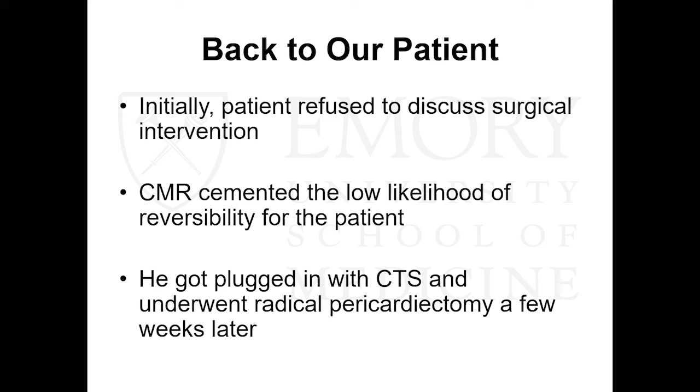So we continued some IV diuresis while he was in the hospital, and we were able to look into the CMR. At the time I didn't really understand how CMR would help us understand the reversibility of this. But looking at some of the data that I just presented, we were able to get really concrete data for him and show him that he probably wasn't going to have a reversible outcome. Some of our patients with constrictive pericarditis are going to have reversibility. He's probably not one of those patients.